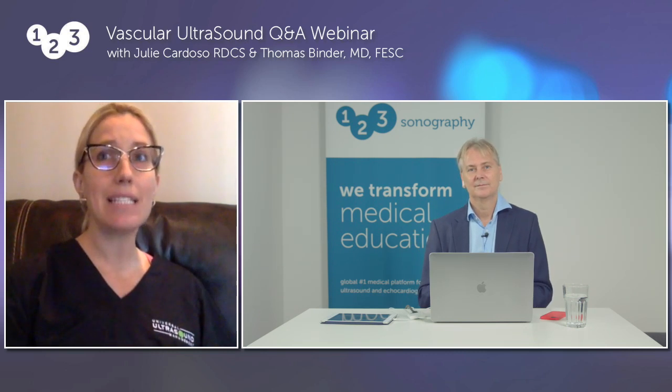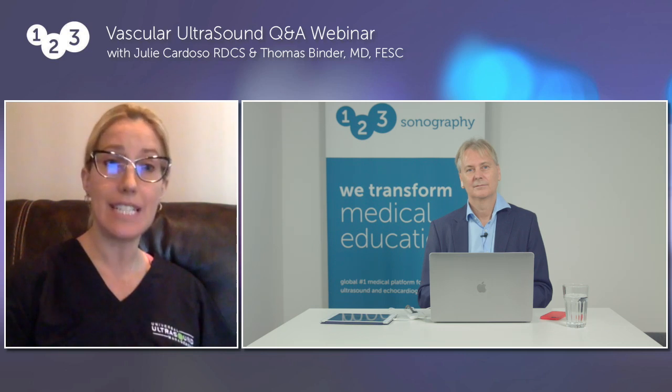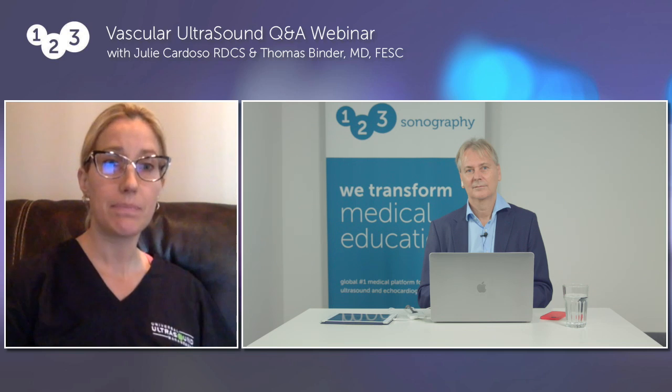Muscular, it depends on where we're insonating, whether it's the calf or the thigh. Usually it's patients that have a lot of edema, cellulitis, advanced stages of arterial and venous disease where the skin is necrotic and there are wounds. These patients are really hard to image, and also patients with higher BMIs.